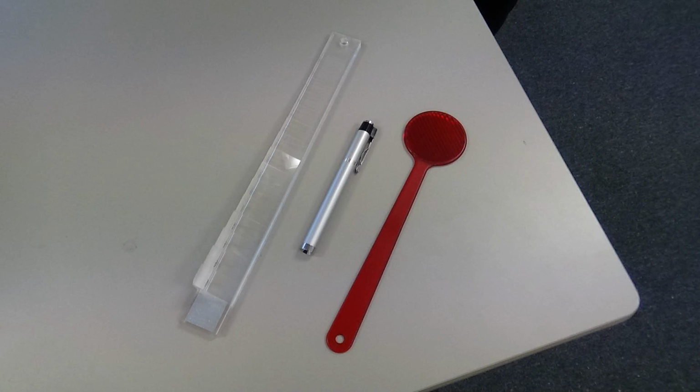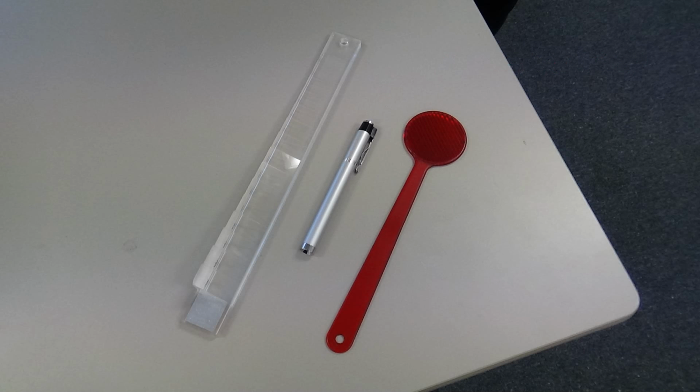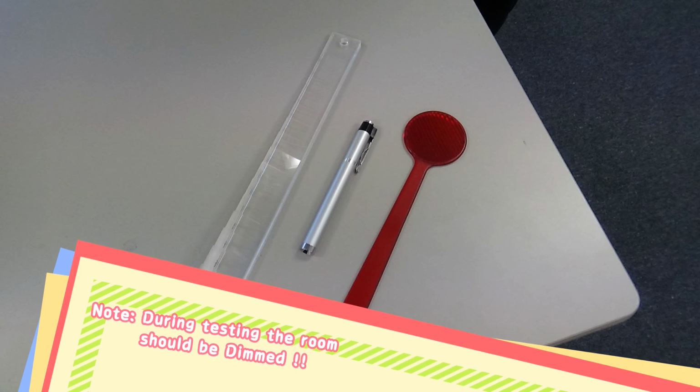Equipment required in Maddox rod testing are a Maddox rod, a light source for near and distance, and base in, base out, base up, base down prisms. Note, during testing, the room should be dimmed, however, due to the circumstances, the light will be on.